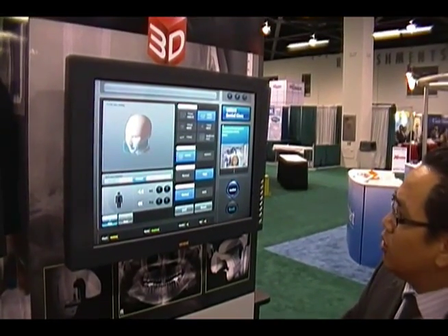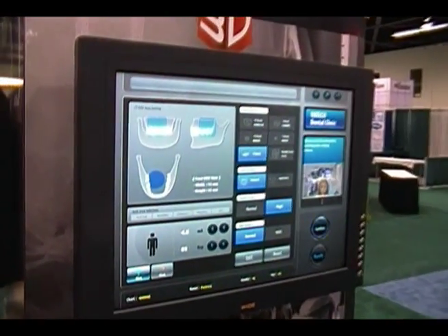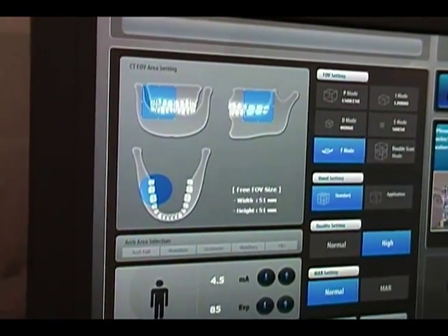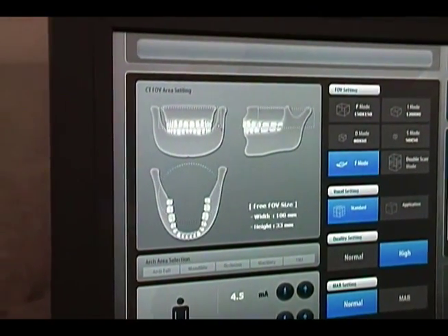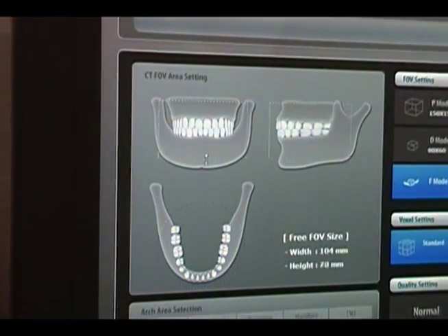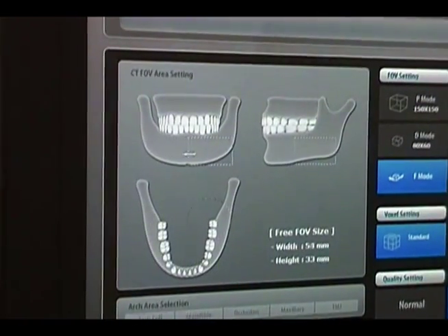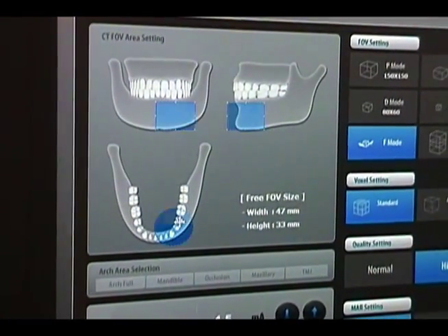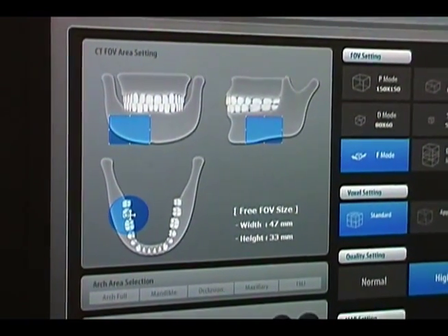One thing that makes this device extremely user-friendly is what we call a free FOV mode. As I mentioned, we have preset field of view sizes, but the staff member can actually customize what type of field of view they want to capture. So if you only want to capture a single arch, you can do so. If you want to capture both arches, all you have to do is draw this line and bring it down. This allows you to limit the exposure depending on what you're trying to capture. In terms of positioning, you position the patient the same way for all scans, then just choose the area you want to capture, and the machine will automatically move into the correct position and acquire the scan. We are the only device that has this capability.